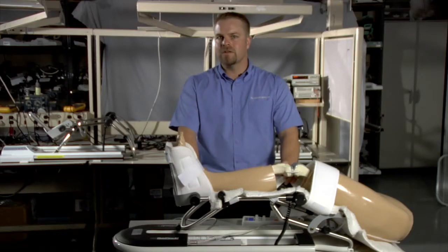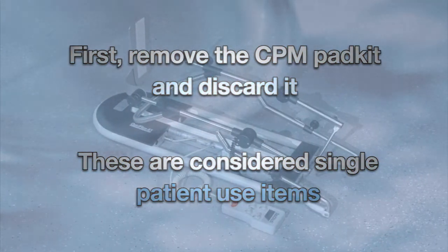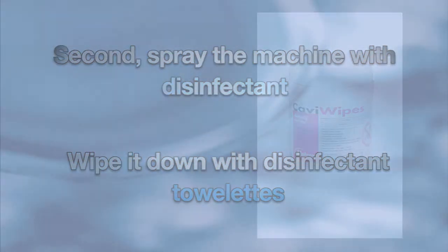We recommend cleaning your CPM machine with a standard disinfection protocol after each patient. First, remove the CPM pad kit and discard it. These are considered single patient use items. Second, spray your machines with disinfectant and wipe them down with disinfectant towelettes. Be sure to remove all tape and other large debris before disinfecting.